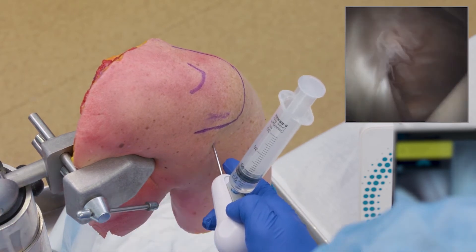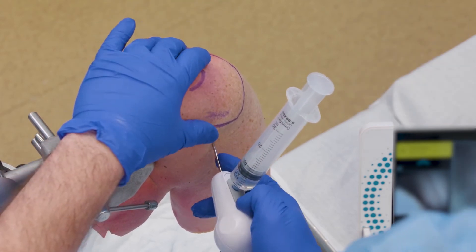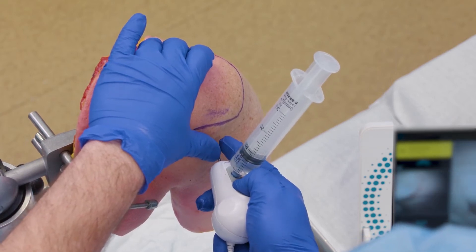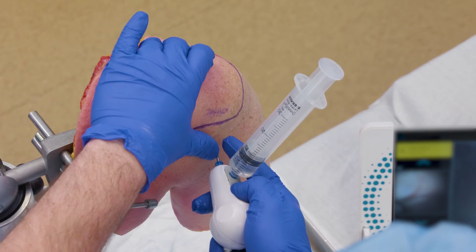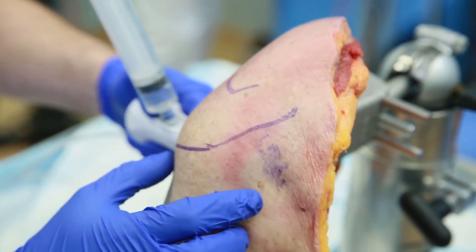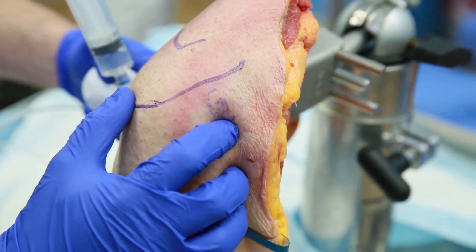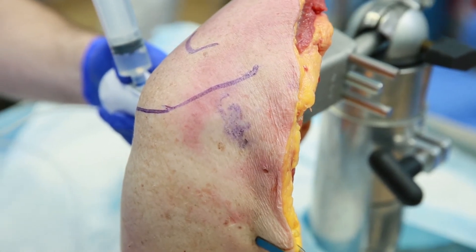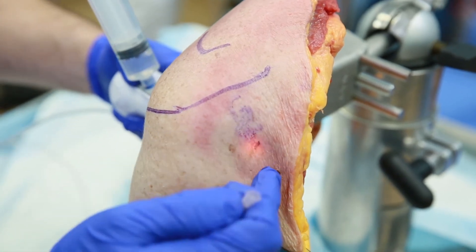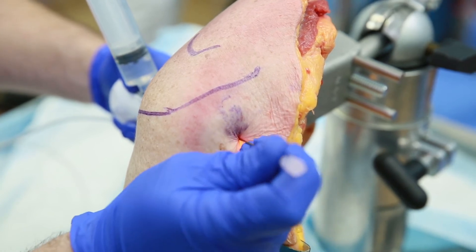If you have trouble finding it, one trick is to drive right up to where that rotator interval is, retract my optics a little bit, and push up right to the skin. I can actually look and see on my skin where the optics want to push through and palpate it right here — I'm feeling just through the skin my eye. With my optics out I can see the light source a little bit. I'll take my 18-gauge needle and go through my previously anesthetized area, feeling my eye poke through the skin, and put my needle right through that interval.